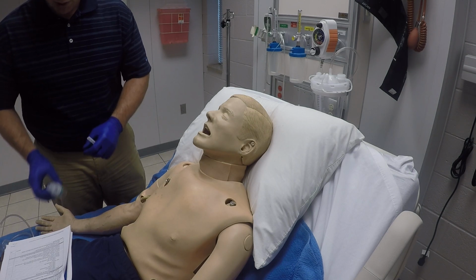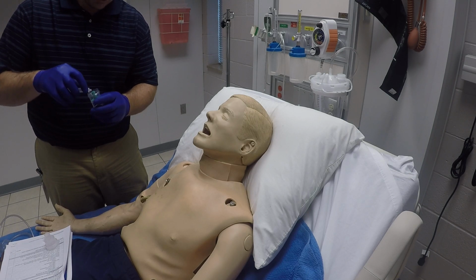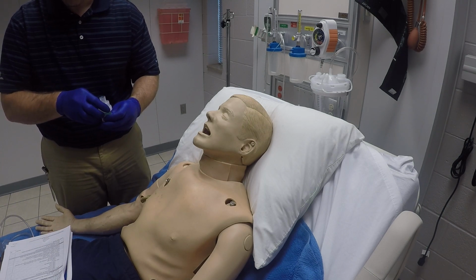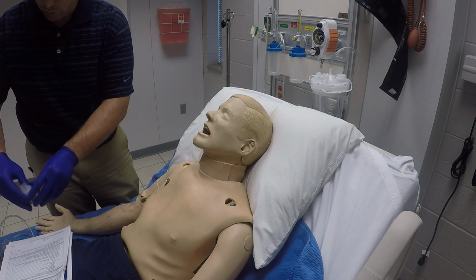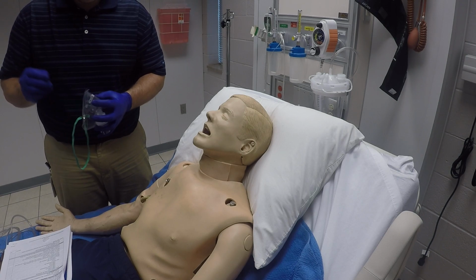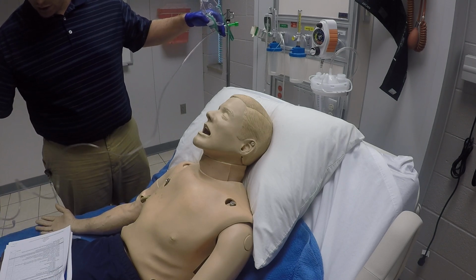First thing we're going to do is take our nebulizer unit here, unscrew it, and place our medication inside of that. Alright, we can go ahead and take our mask here and place it onto the nebulizer unit. You can also use the mouthpiece, which the patient actually holds, but the mask a lot of times is easier for you to use. We'll go ahead and set up our oxygen tubing.